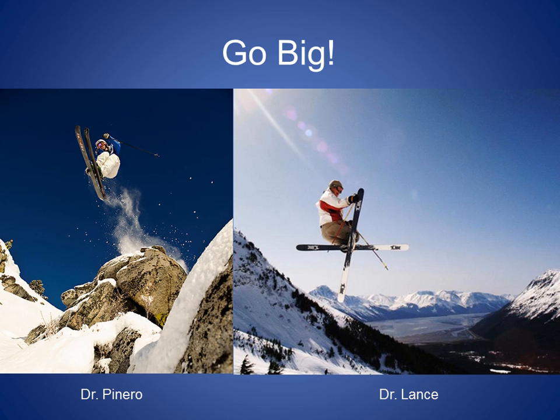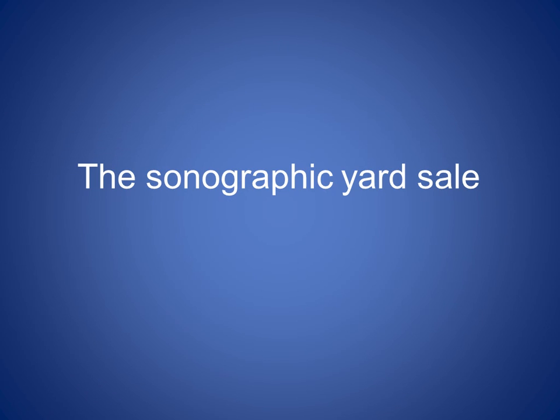And so, too, when we do our ultrasounds, we need to have a plan and a point of reference. Otherwise, we're totally going to eat it. And we'll have the sonographic yard sale, much like this guy.